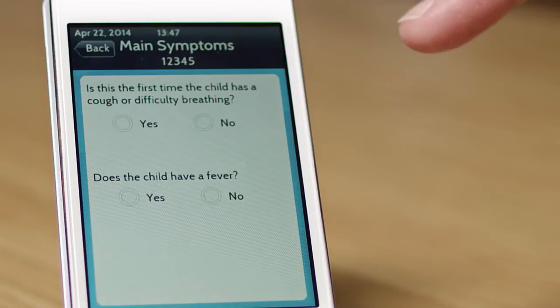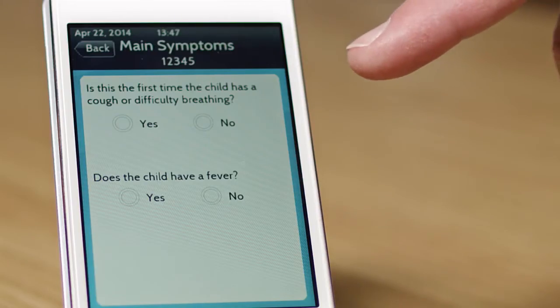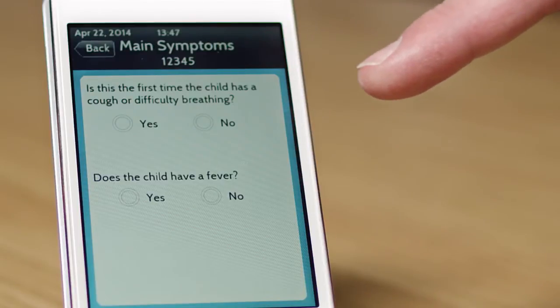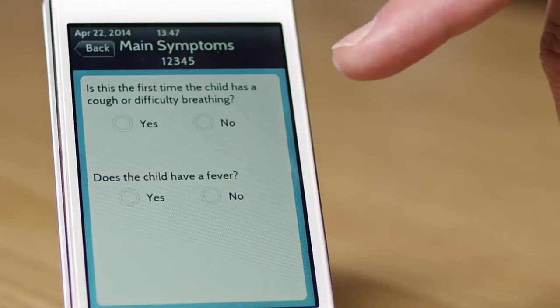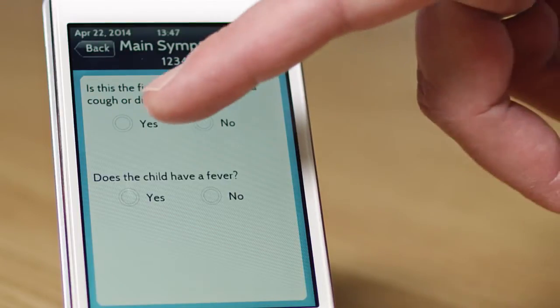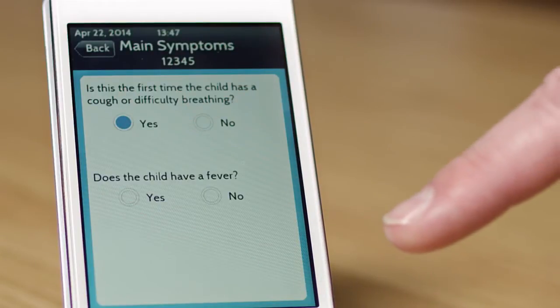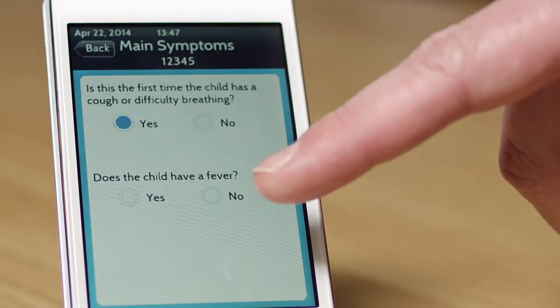The first part of the screen here is just an input field where we can tell the system something about the child — whether or not the child has cough or breathing problems for the first time or not. We're going to say it is the first time, and also whether or not the child has a fever.